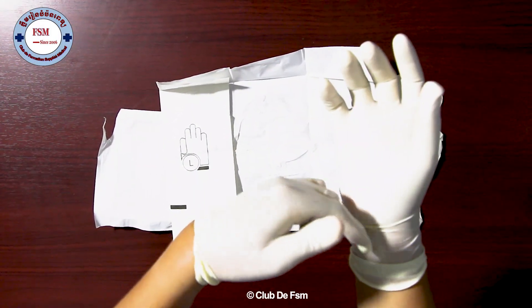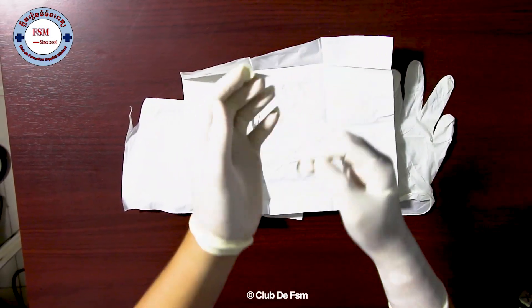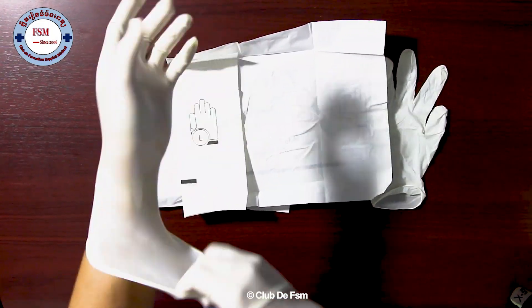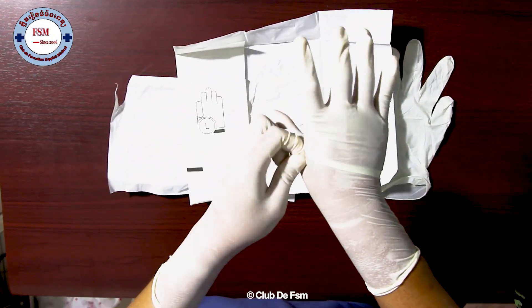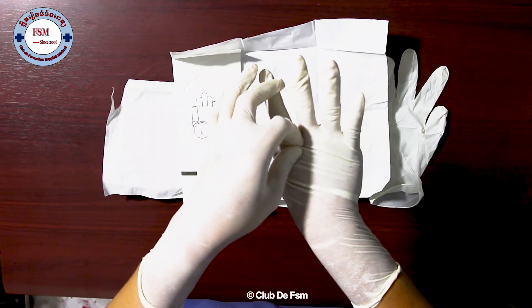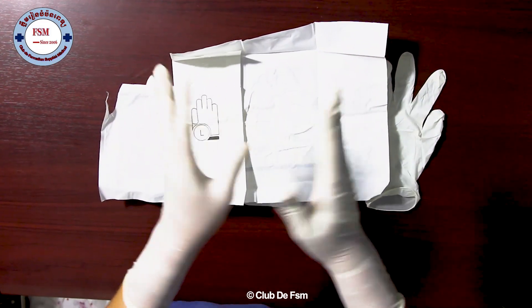This is a sterile zone. We can do that. This is a sterile zone also. This is how to put on sterile gloves. This is easy for medical students, and junior medical staff can perform it well. It's finished.